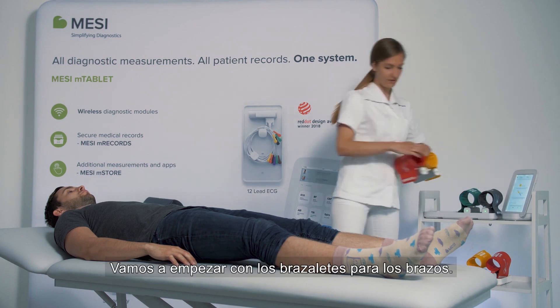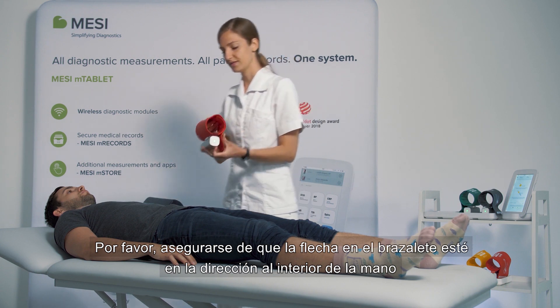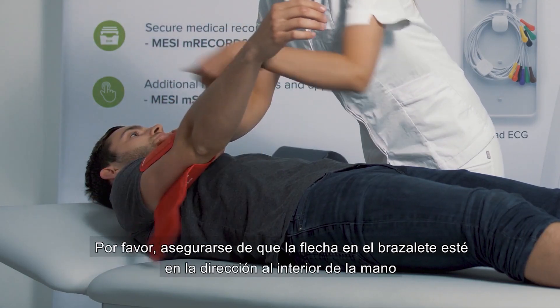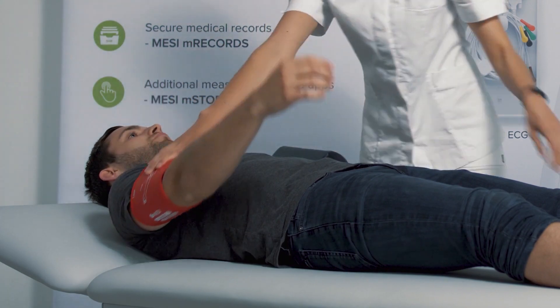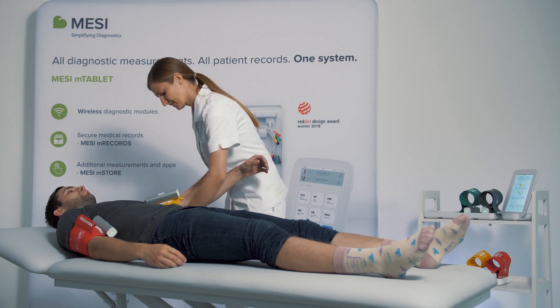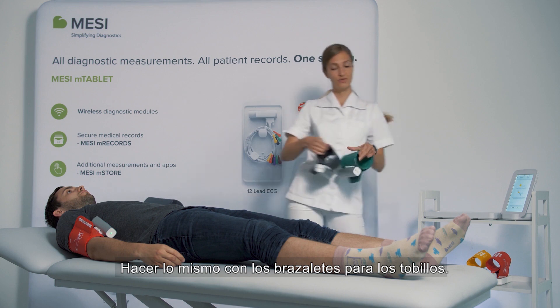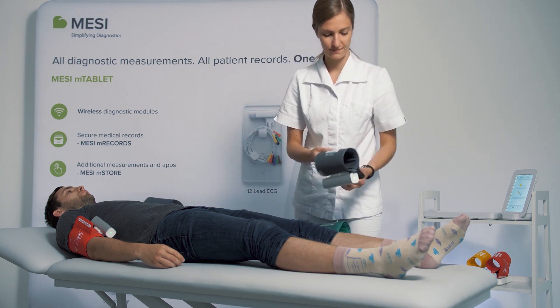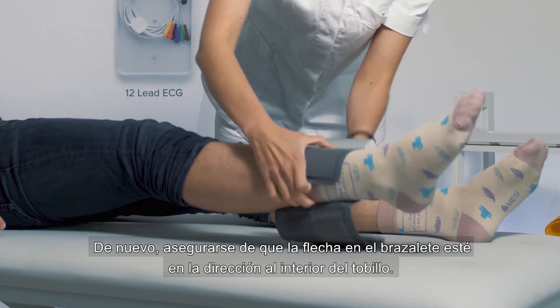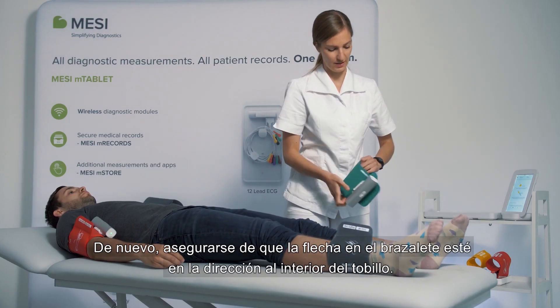We will start with the arm cuffs. Please make sure the arrow is turned to the inner side of your arm and that they are fastened sufficiently. You do the same with the leg cuffs, making sure that the medial ankle arrow is pointed towards the inner ankle.